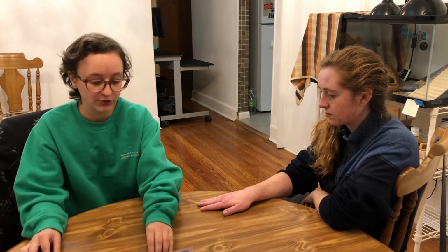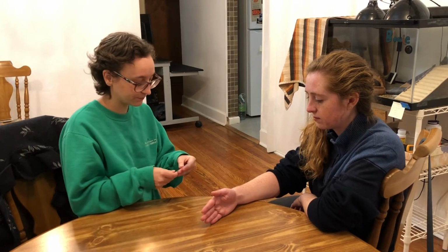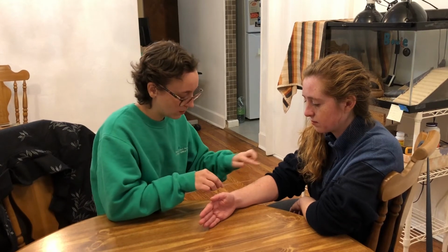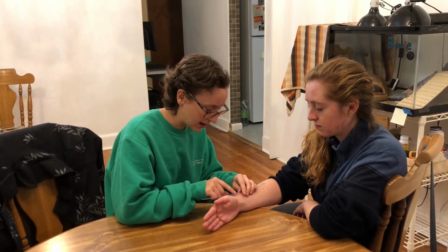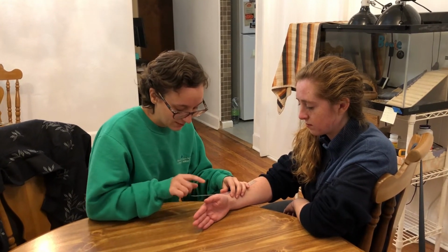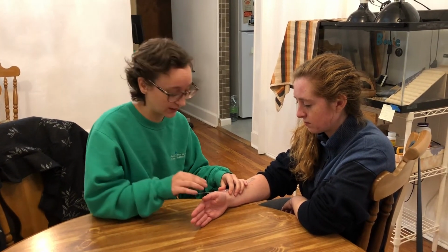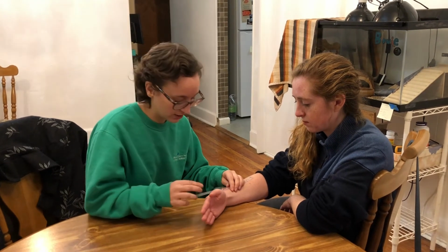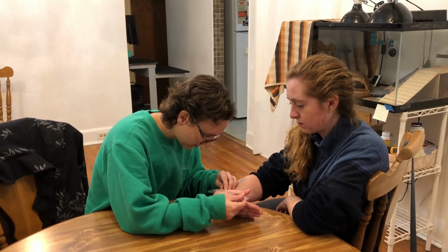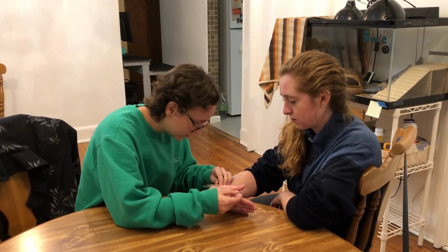So now I'm going to do flexion and extension of the wrist. I'm going to have you have your hand on the side just like that, and I'm going to put my stationary arm aligned with her forearm. Again, the fulcrum I'm going to have over her radial styloid, and I'm going to be aligning my movement arm with her index finger. Whenever you're ready, go ahead and just bend your wrist forward into flexion as far as you can. Okay, for wrist flexion, I'm getting about 83, 85 degrees.